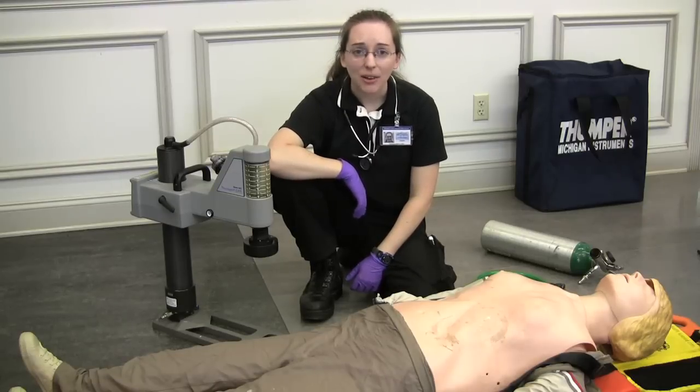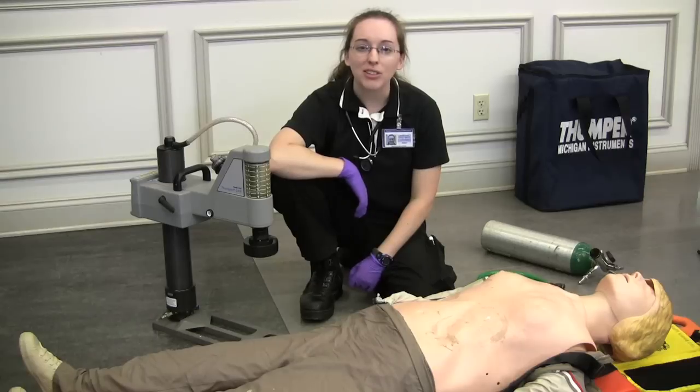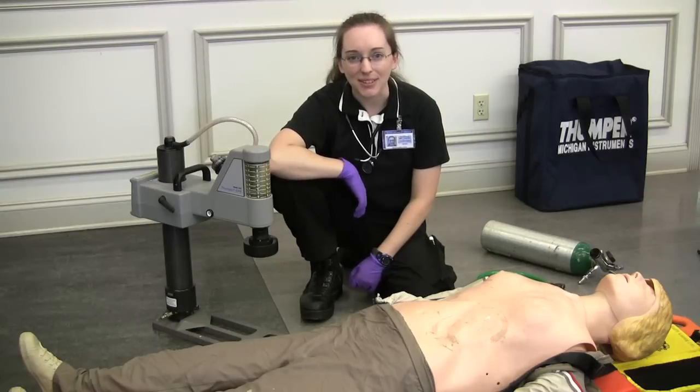And that is how you use the Michigan Instruments Thumper CPR System, model number 1007.